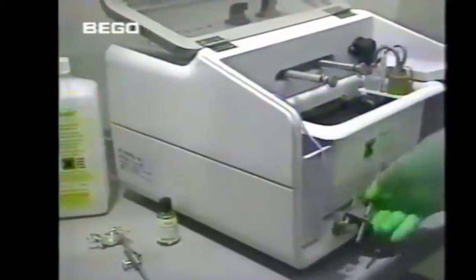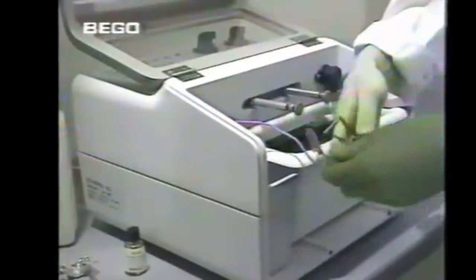The object is secured with an alligator clip and attached to the moving anode. An additional cathode can be attached to polish the stippled palatal area adequately as well. The tip of the curved copper rod is fixed at the lowest point of the upper base without coming into contact with it. Firm and secure contact is important for a good result.